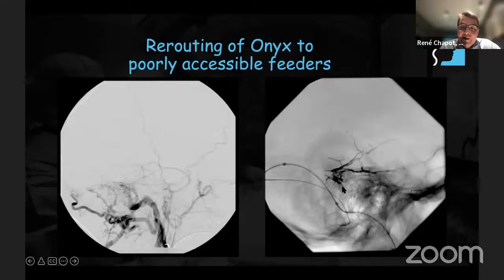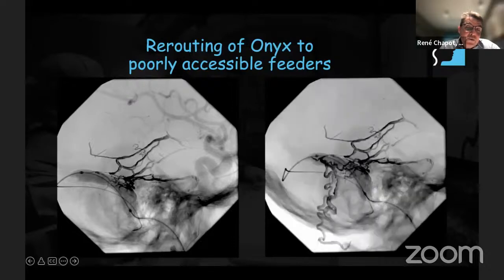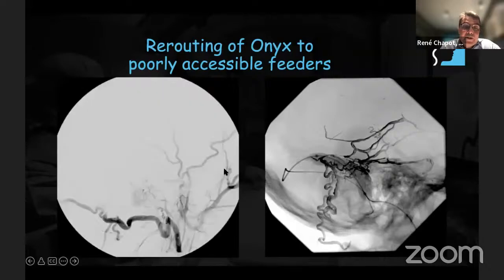And as soon as it reaches the sinus, there's a balloon that we developed, which is a very compliant balloon, so it does not compress the dura, and which allows diffusion from here to the non-accessible arteries. And this changed our life for dural fistula, because this way we can cure dural fistula with a single step of transarterial embolization under control of this balloon, which of course, this is a very simple one.